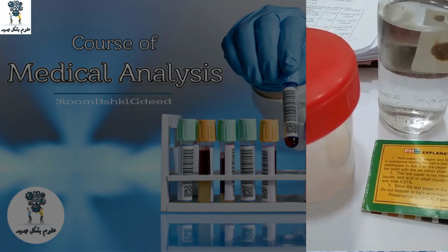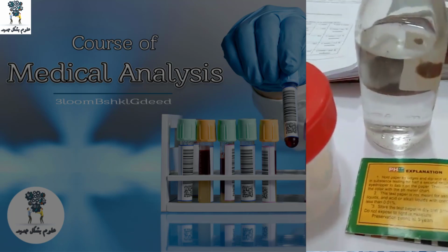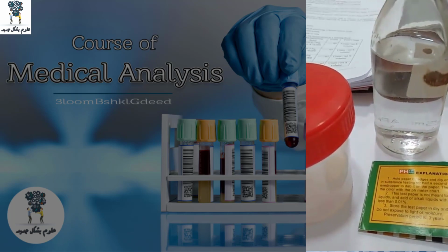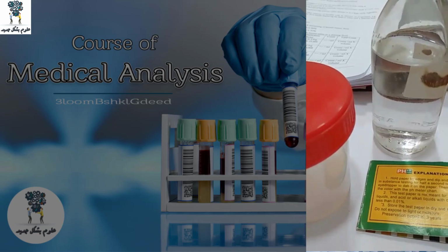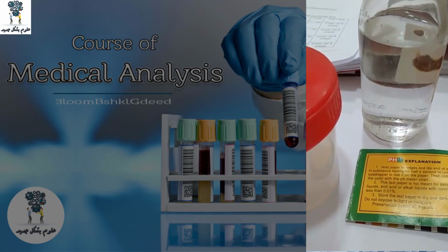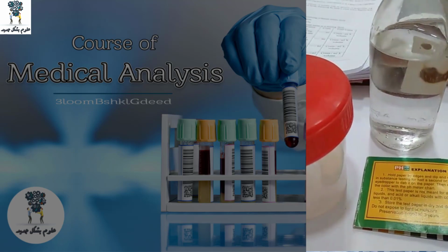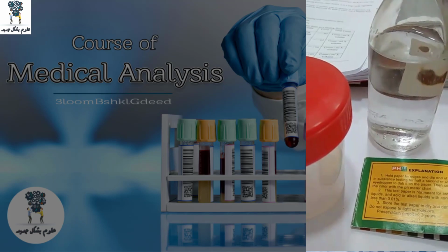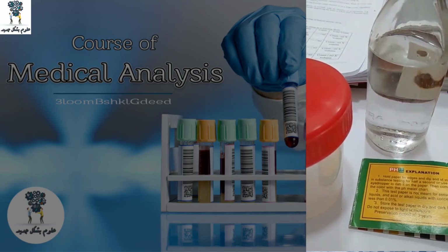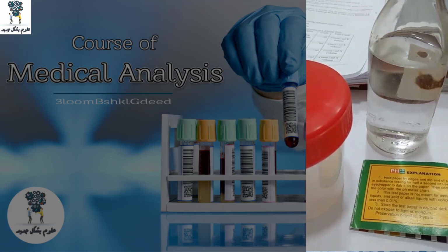There are other cases where sperms are called progressive, and there is another terminology called non-progressive. What is progressive here? Progressive is a word that describes sperm that can actively move. So in this case, we call it progressive.